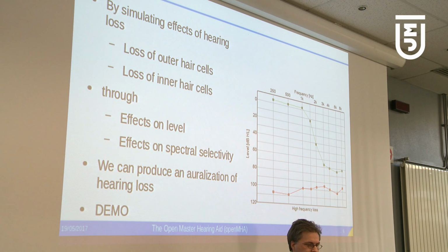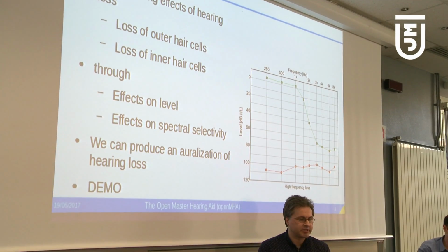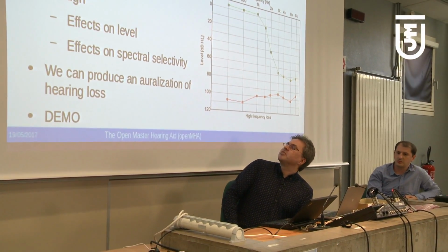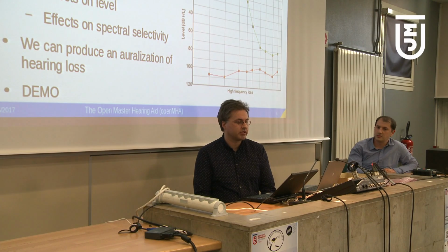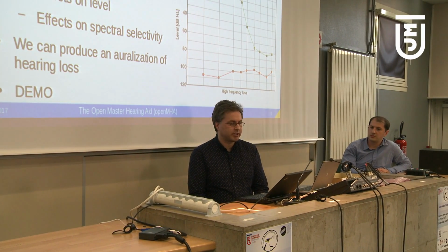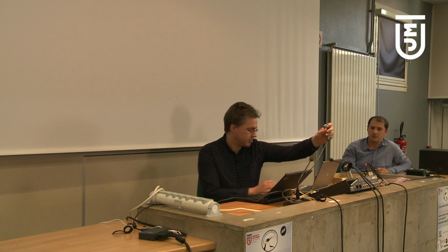Now I want to try to show you a demo. What does hearing loss actually sound like? And we can do a demo by doing signal processing and simulate in signal processing the effects on level and on spectral selectivity of the loss of outer and inner hair cells. So I will switch to this other computer.